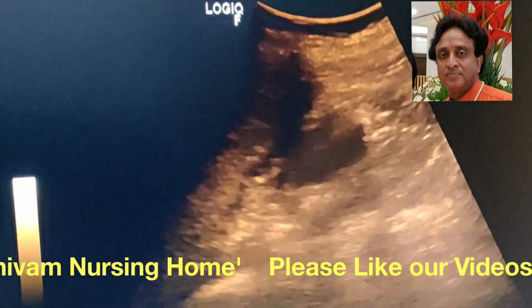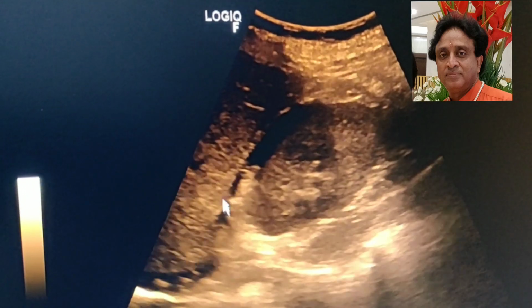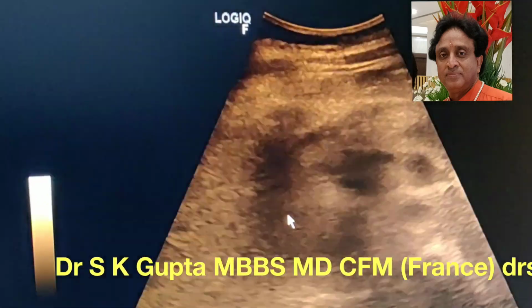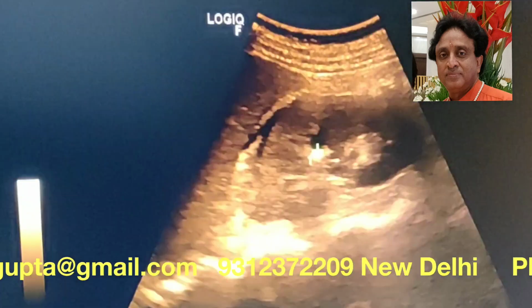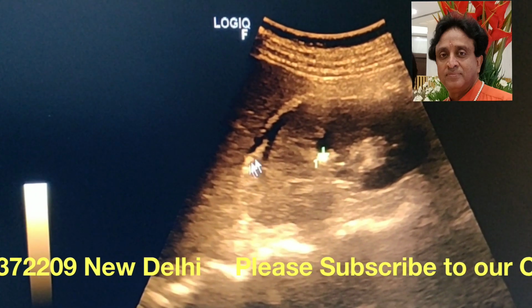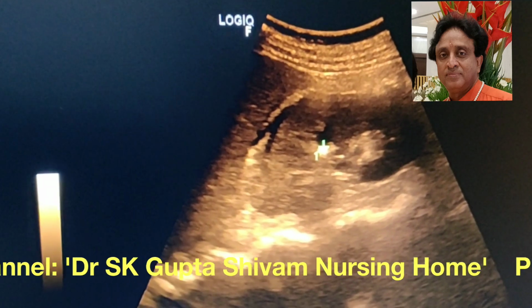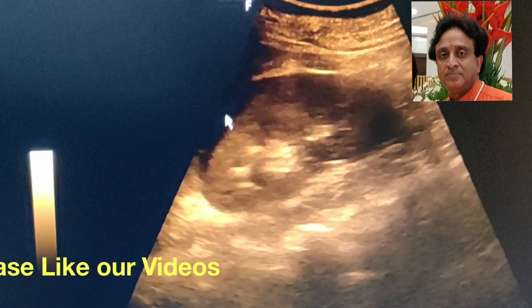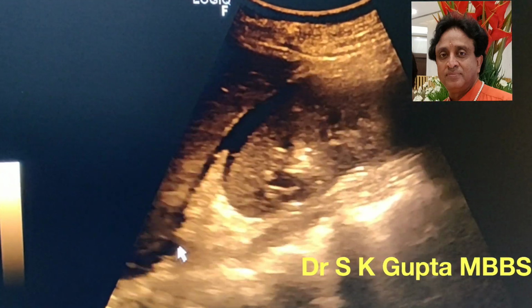And here you can see that there is free fluid in the Morrison's pouch. This is the kidney, and this is the liver, and there is a small streak of fluid in the Morrison's pouch, which suggests that this is a case of ascites. And here incidentally the patient has a small stone also, but as you can see, in the Morrison's pouch there is some fluid seen. You see the Morrison's pouch again. This is the free fluid in the Morrison's pouch, and there is free fluid around here in the lower part of the liver also.